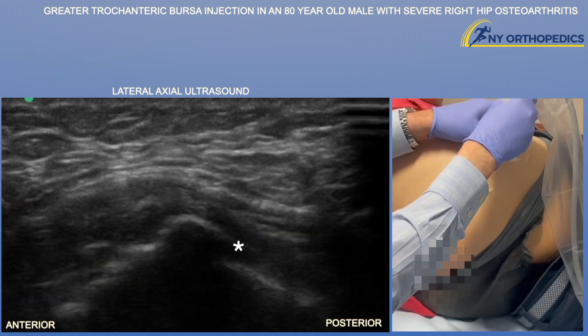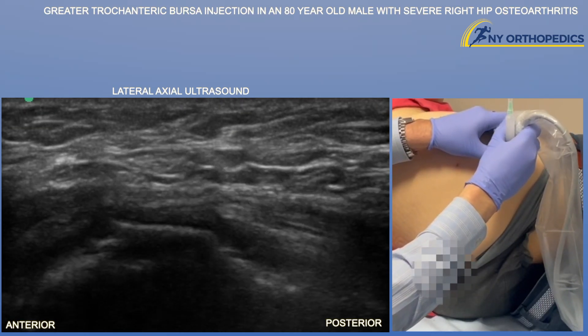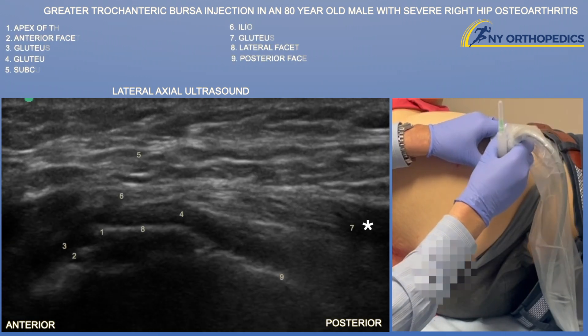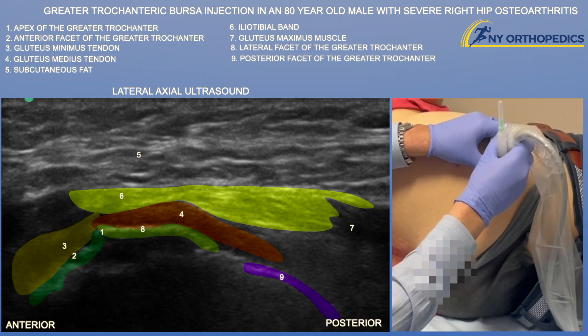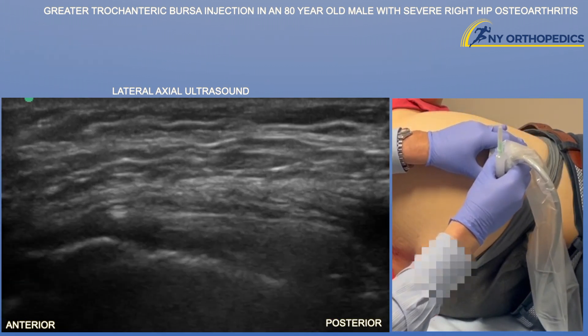Here you can see the anterior and lateral facets and the gluteus minimus and medius tendons, which overlie those facets. We can also start appreciating the iliotibial band — the gluteus maximus muscle feeds into that band from a posterior perspective, and the tensor fasciae latae muscle feeds into it from an anterior perspective.